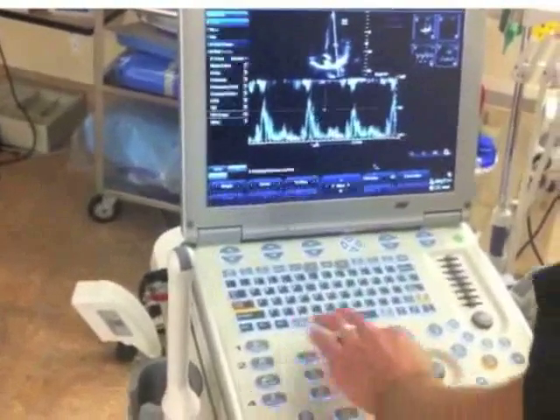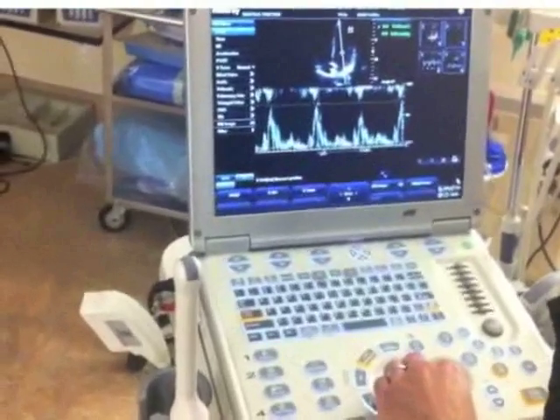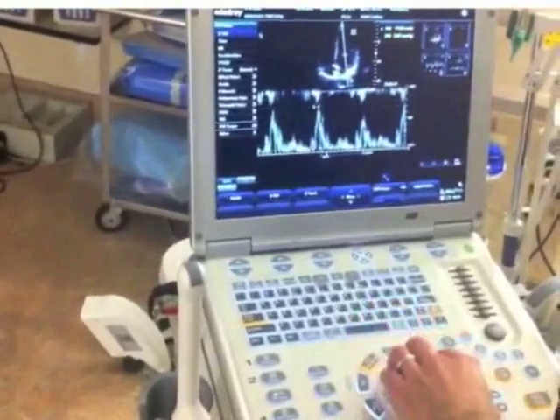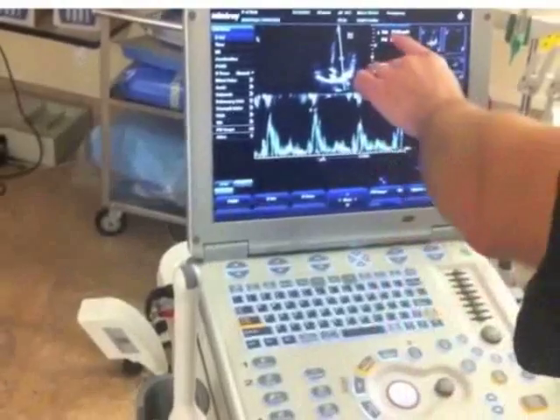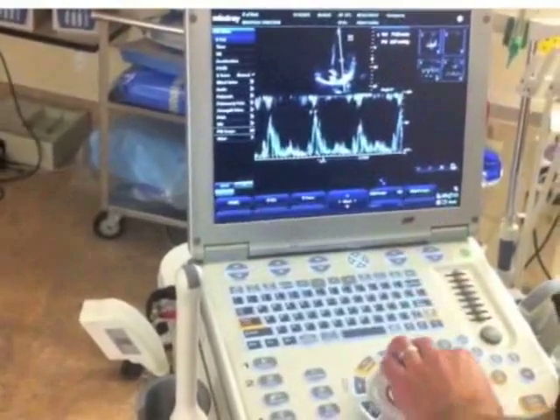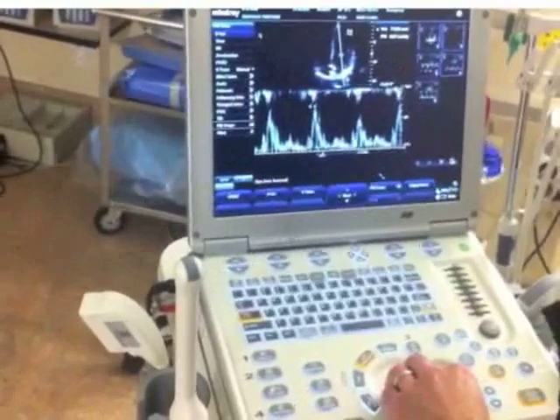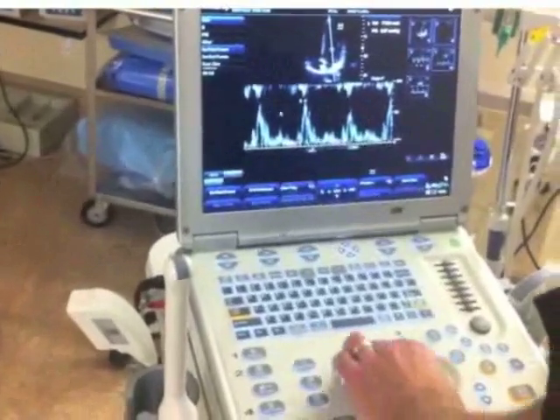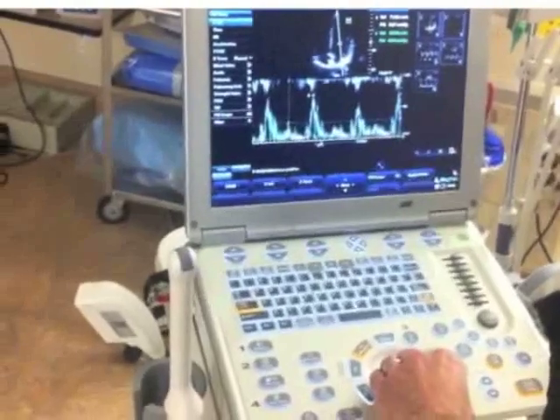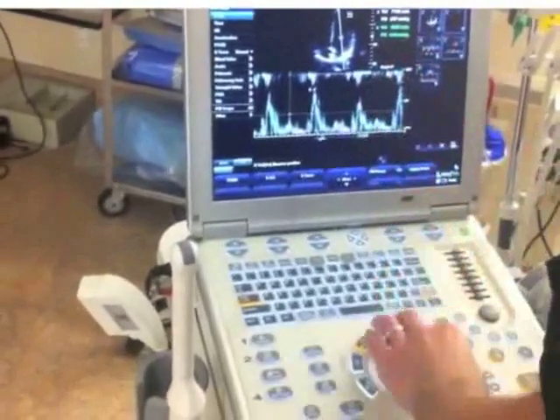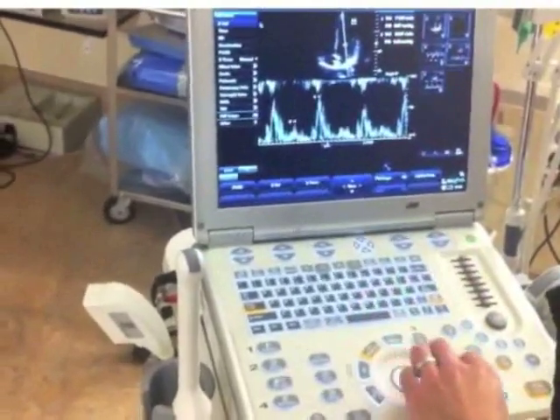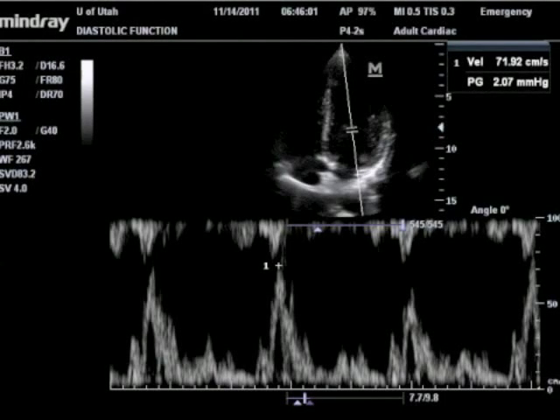What we can do is measure the E wave velocity here. This E wave velocity is 71.9. And if we wanted, we can measure the A wave velocity too, which is 34.07 centimeters per second. So this is a normal inflow pattern where the E is greater than the A, but the E is not super huge — you can see it's less than 100.